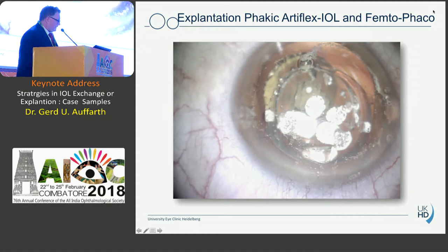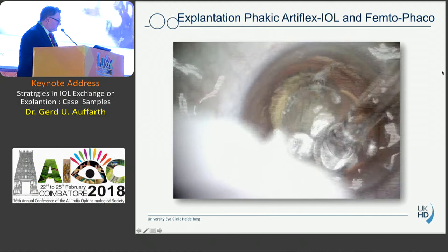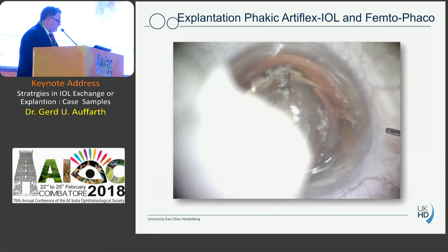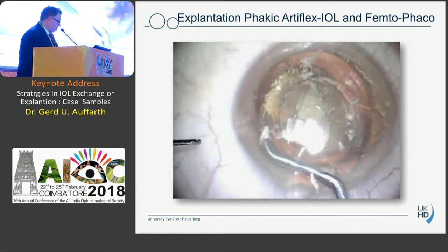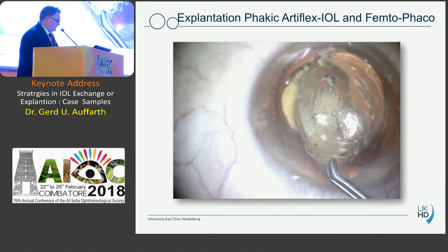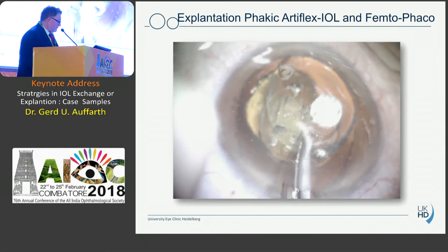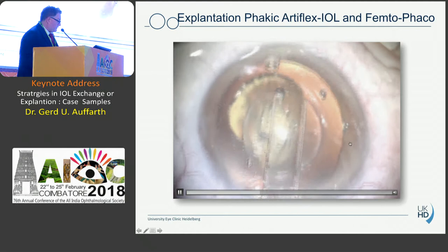It becomes tricky if you have a lens fixated in the iris, like this Artiflex lens. We already did a femtosecond laser capsulotomy and fragmentation, and now we have to de-enclavate the lens using specific instruments. You hold the haptics and with a spatula go through the paracentesis to de-enclavate the lens. You need this specific forceps to have a firm grip on the haptics. As the lens is pretty soft you don't need to enlarge much — the incision is about 3 mm — grab the lens, apply counter pressure with the spatula, and take it out.